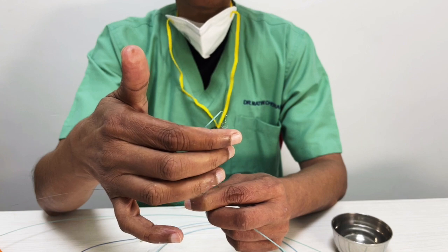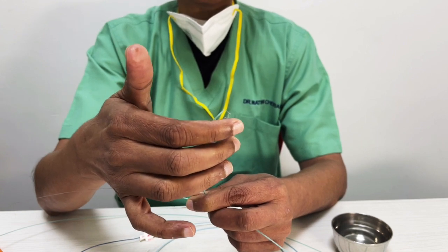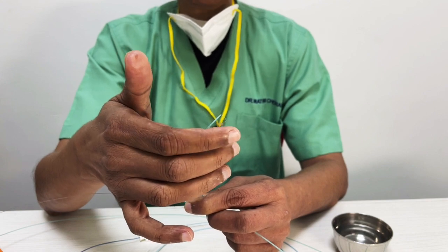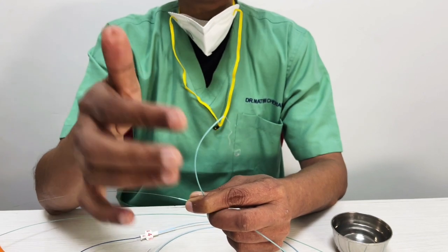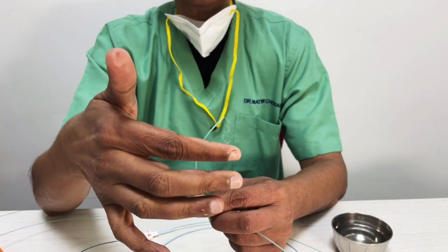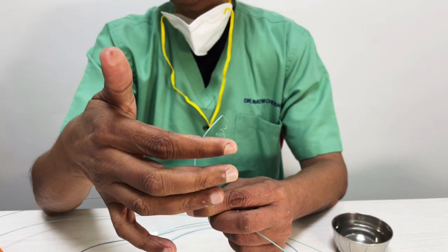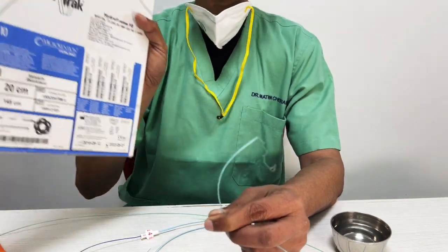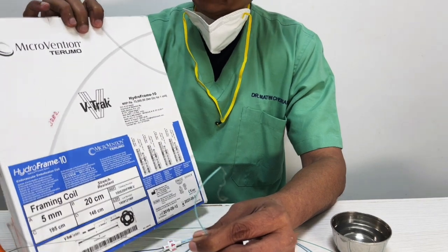The only coated coil that is still available are the hydrogel coils. Hydrogel coils made by Microvention, they make it more slippery. They also allow one thing, basically they swell up a little bit. So we will call them hydro coils. Anything which has the word hydro written is basically a coil made by them, with a coating. So have a look at this.